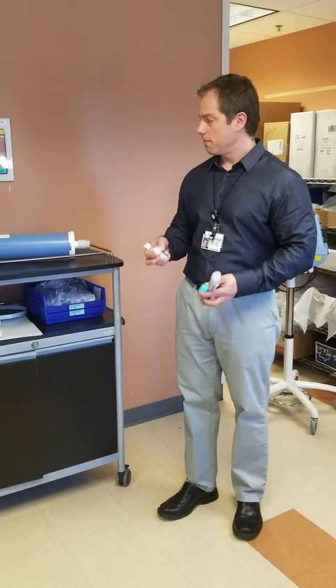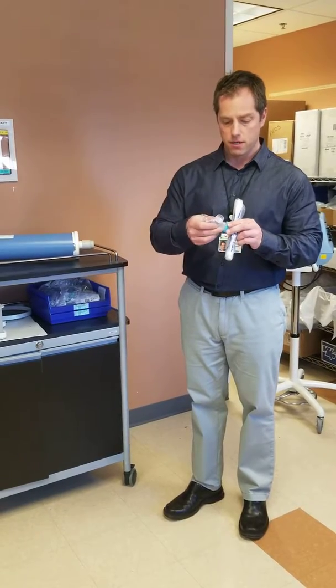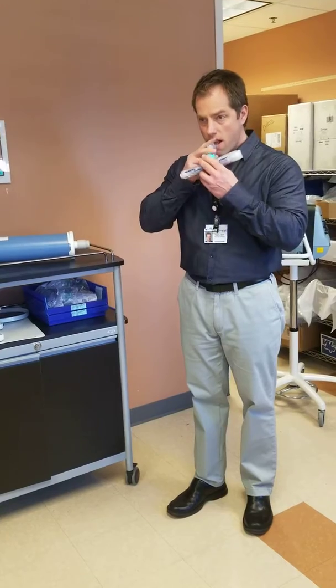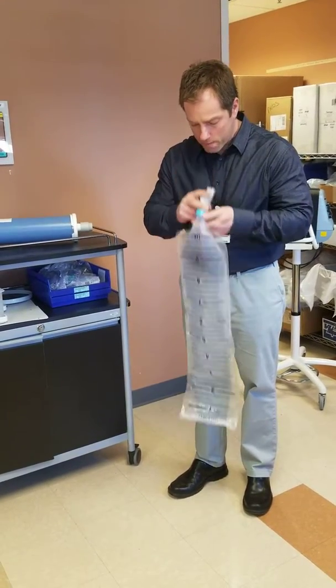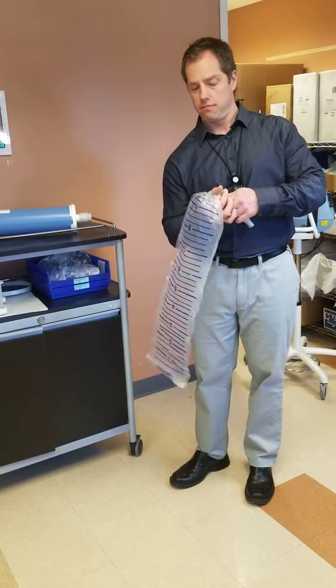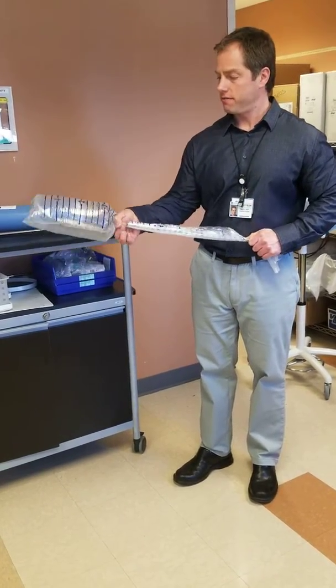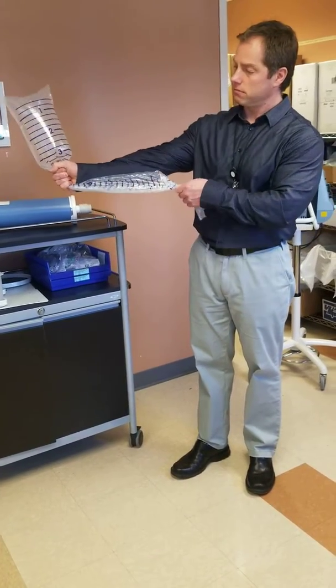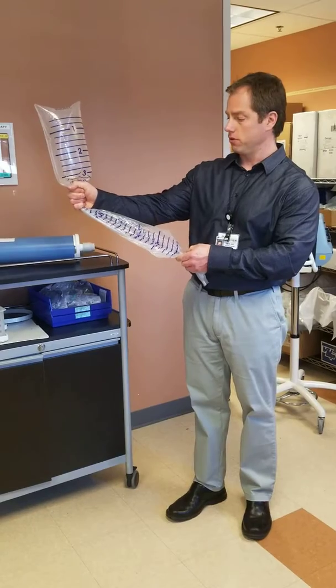We have this bag with a one-way valve mouthpiece, and the patient just blows into it. I'll do that right now. Then go down and you should have a ballpark reading — that's about 3.25 liters is what I blew out that time.